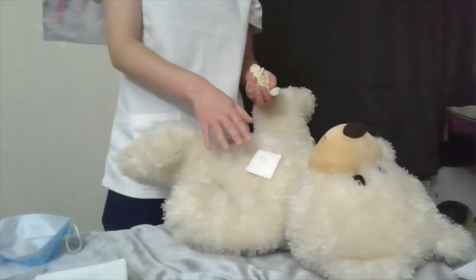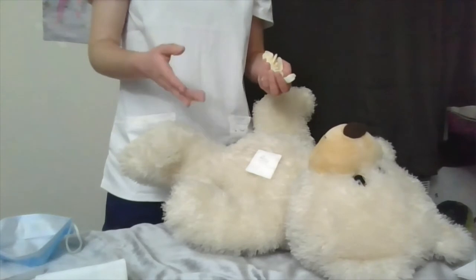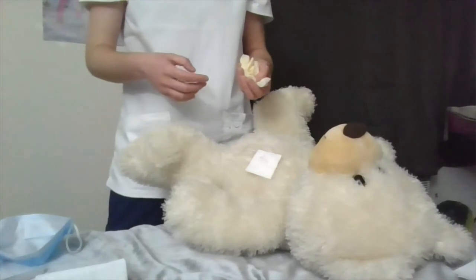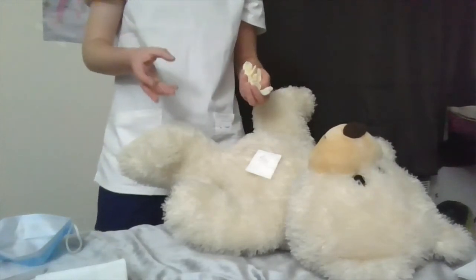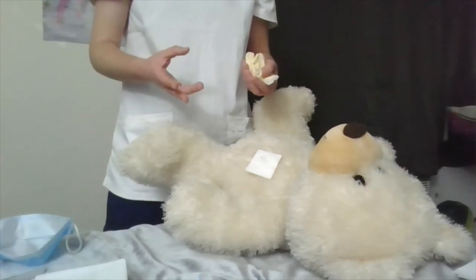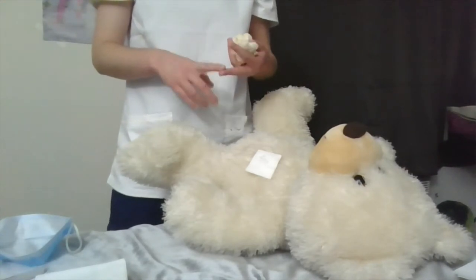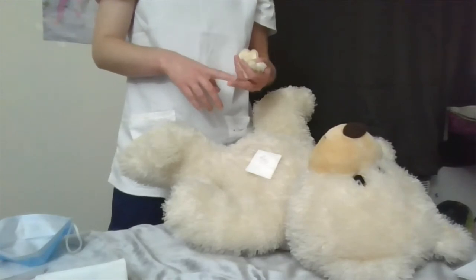We're also going to confirm the location and make sure it's in the correct location. Documentation should include the location, the length, and the measurement of the line. We're going to include the skin assessment — assessing for any signs of infection and making sure the tissue looks fine. We're also going to document what care we performed during the dressing change and identify that we used sterile technique.